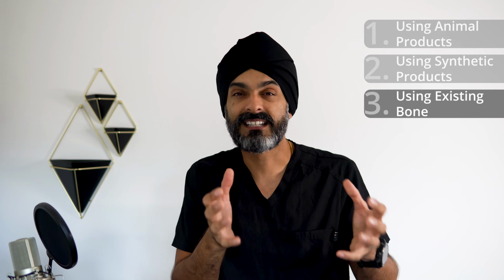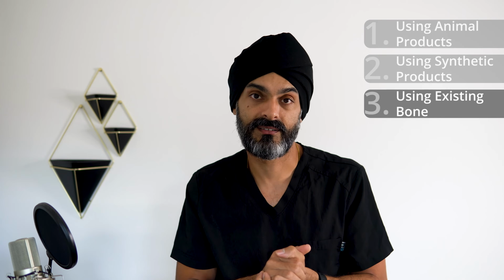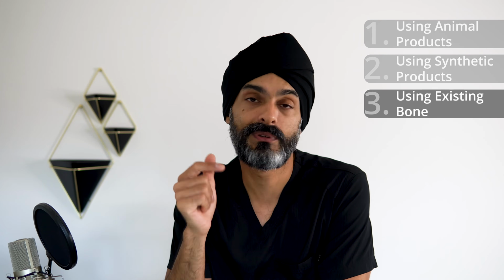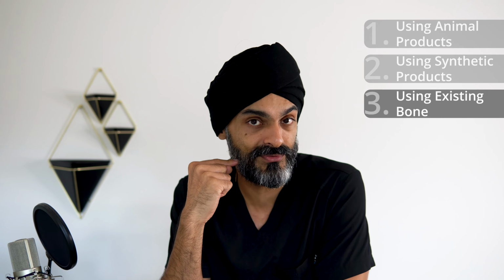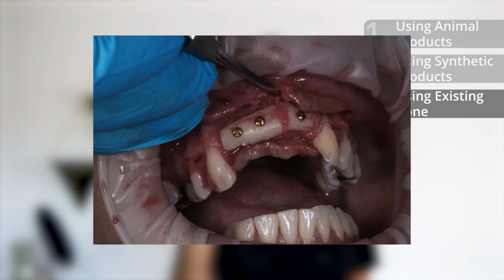So if we've got a tiny little defect, it's so much easier just to use one of the other bone grafting techniques. With this technique, we've got 2 wounds immediately. We've got the donor site where we're taking the bone from, and then we've got the recipient site where we're putting the bone to. And okay, this is a photo of someone who we did this for, and you can see it looks a little bit Black & Decker. You know, we've got screws holding these plates all in position, and it obviously is going to cause a lot of swelling and discomfort afterwards as well.